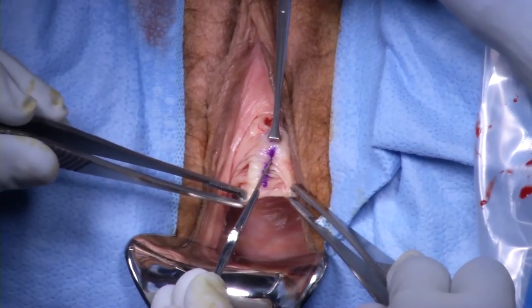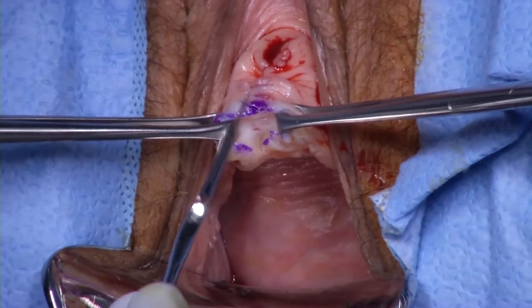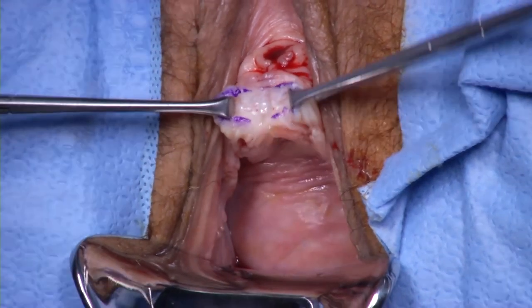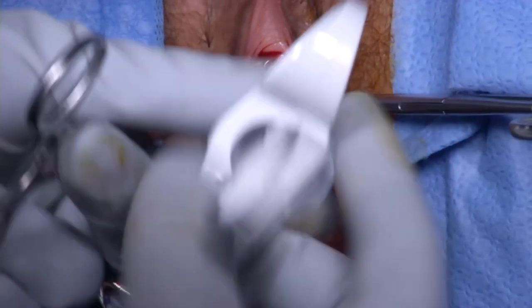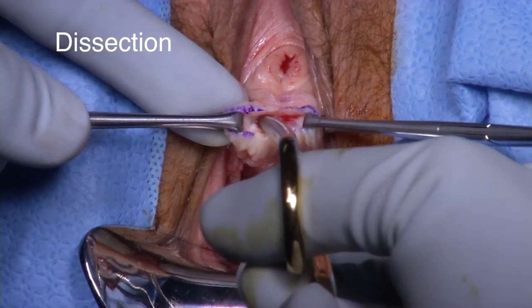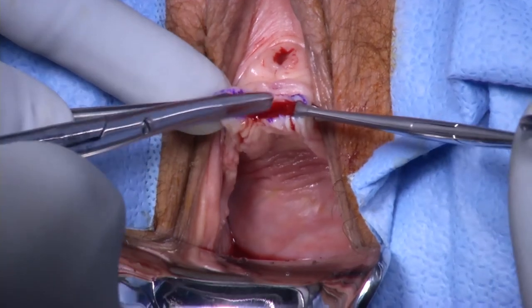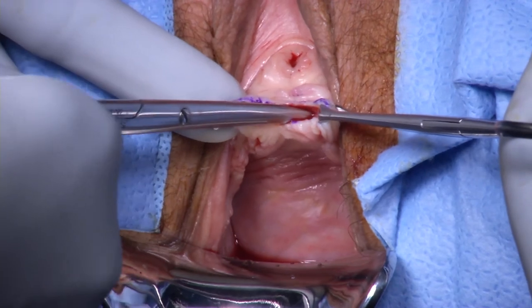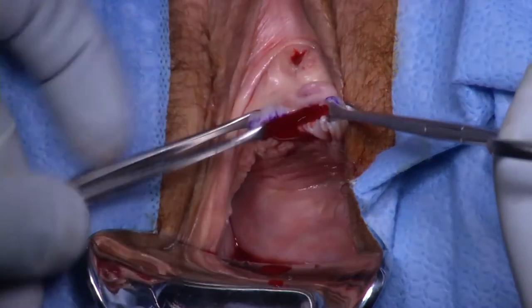An incision is made with a 15 blade. This is a deep cut to maintain a thick layer of vaginal skin. Allis clamps are used for retraction. Additional anesthesia is directed along the tract. Curved Metzenbaum scissors are used to create a tunnel under the vaginal mucosa away from the urethra. Typically only one or two snips with the scissors are necessary. The scissor tips are gently spread while applying mild pressure to dissect 2 to 3 cm lateral to the incision site in the direction of the patient's ipsilateral shoulder.